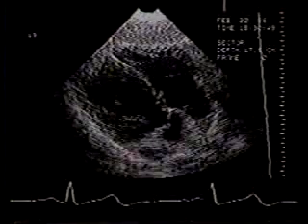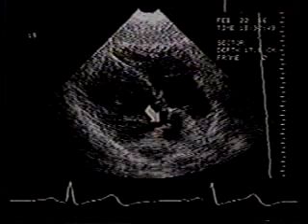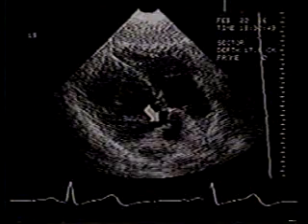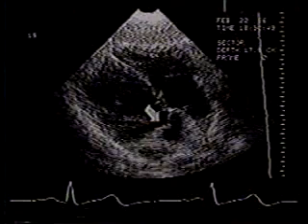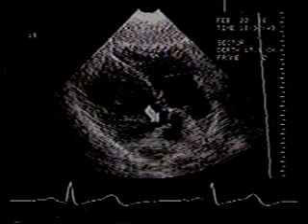By tilting the transducer anteriorly, the aortic valve is identified. Its opening and closing motions can be studied from this position, which is particularly useful for cases in which technical difficulties prohibit an adequate peristernal examination.